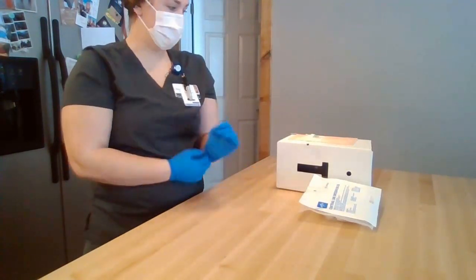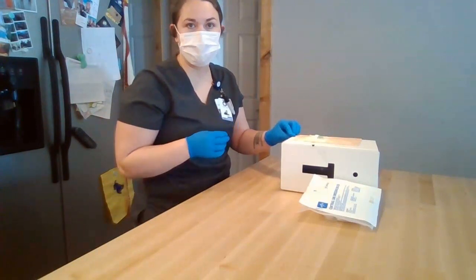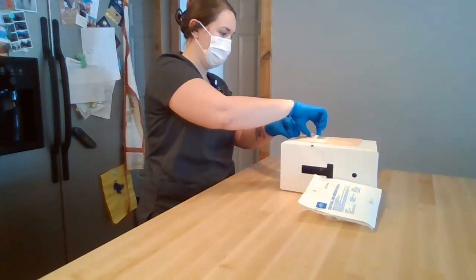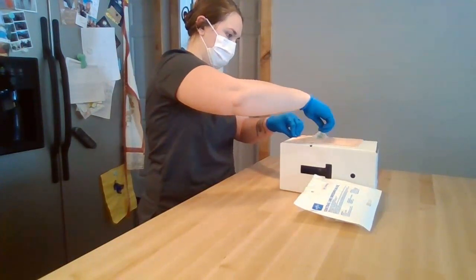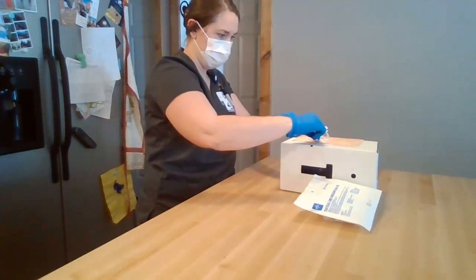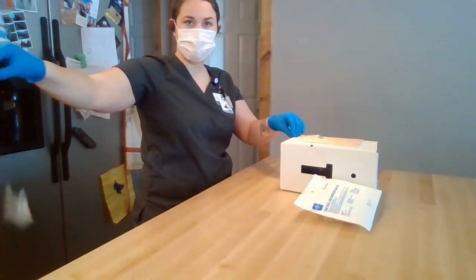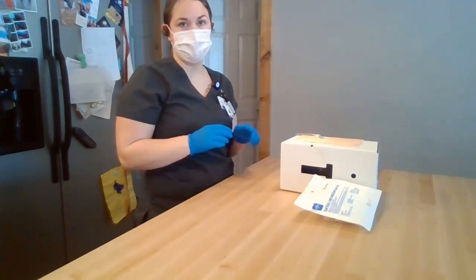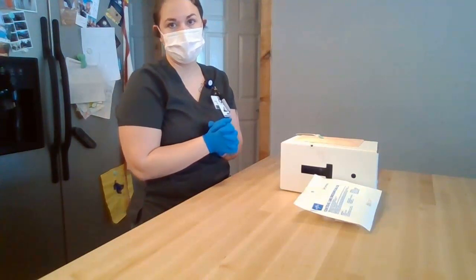I'm going to remove my old dressing by stabilizing it with my non-dominant hand and pulling gently and parallel to the skin on each corner until it has been removed, making sure not to touch the sterile area. Once I remove my old dressing, I can discard it in the trash. I'm going to inspect the catheter, the insertion site, and the area around the catheter to make sure there's no damage, it's in the correct place, and the skin around it is intact and good to put new adhesive on.